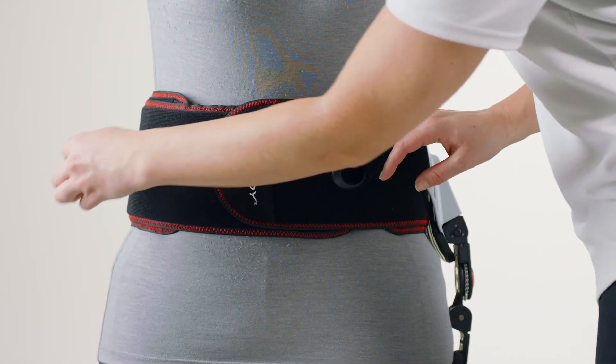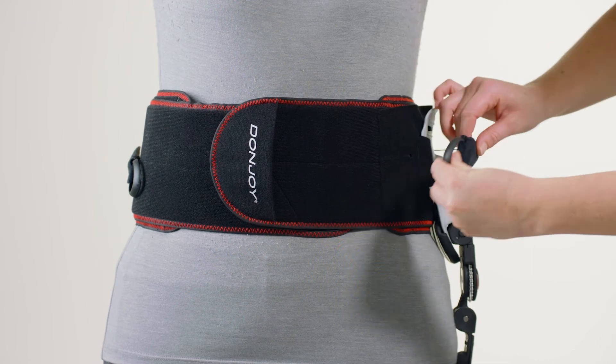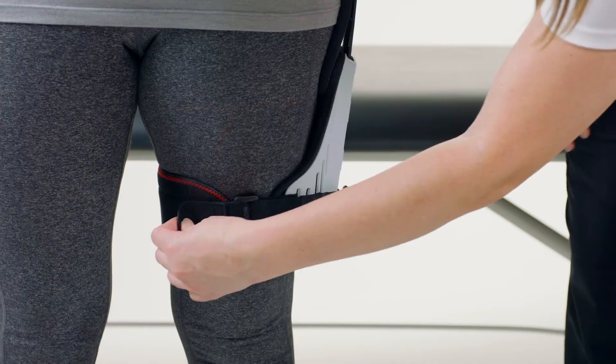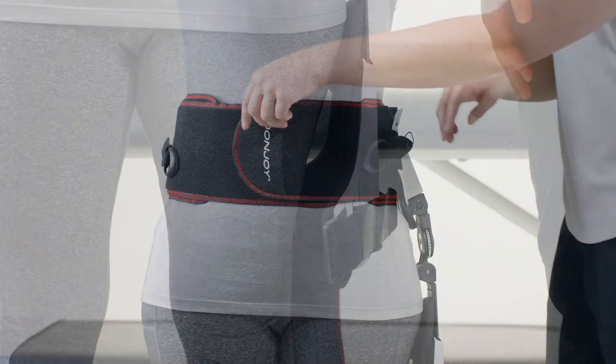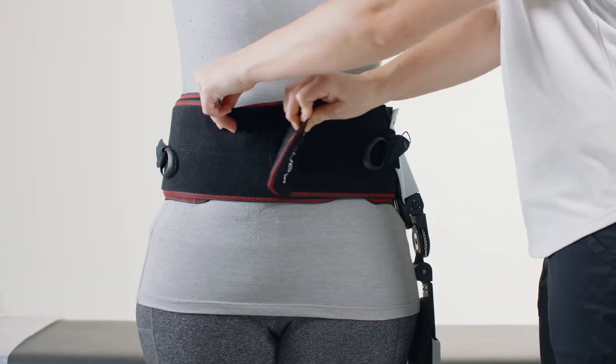Brace removal: to remove the hip brace, detach the pull tabs on the side of the waist belt, then unfasten the thigh cuff, followed by the belt. Remove the hip brace.